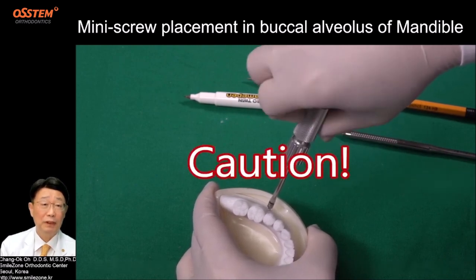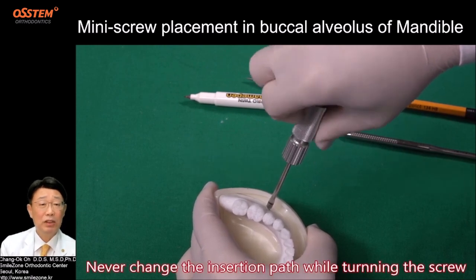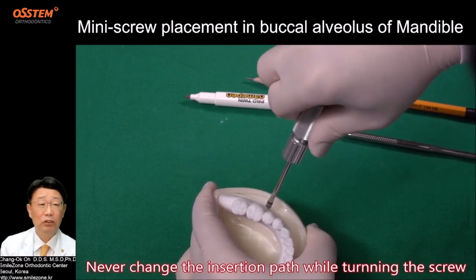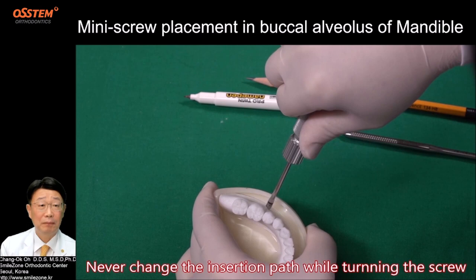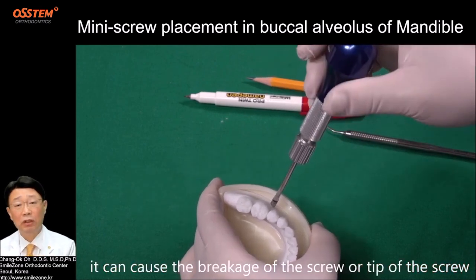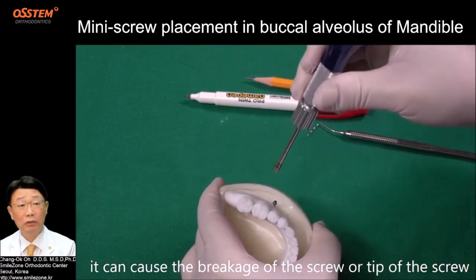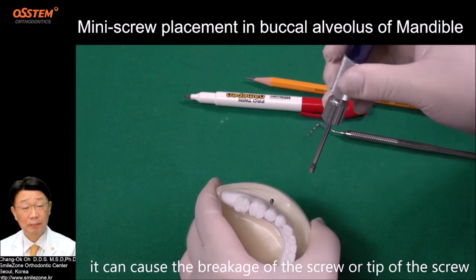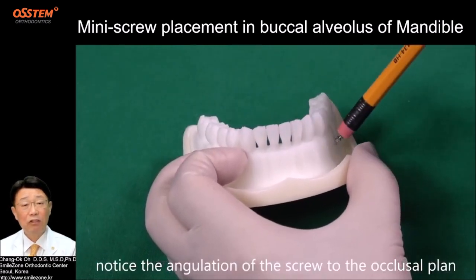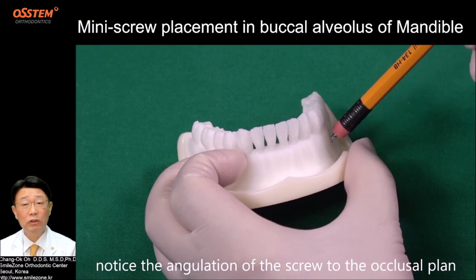CAUTION: Never change the insertion path while turning the screw — it can cause breakage of the screw or the tip of the screw. Also notice the angulation of the screw relative to the occlusal plane.